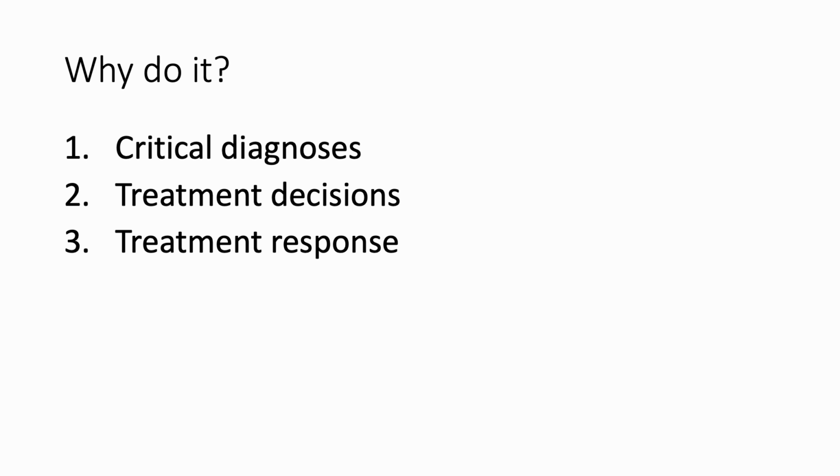So how do we want to treat this patient? So we have someone who's hypotensive, but it's undifferentiated hypotension. Well, this can kind of help tease it out. Is this cardiogenic? Is this hypovolemic? Is this obstructive? And knowing how to use your ultrasound, within 10 to 30 seconds, you can actually uncover some aspects of the patient's physiology that can push you in a different direction of how to treat this patient.